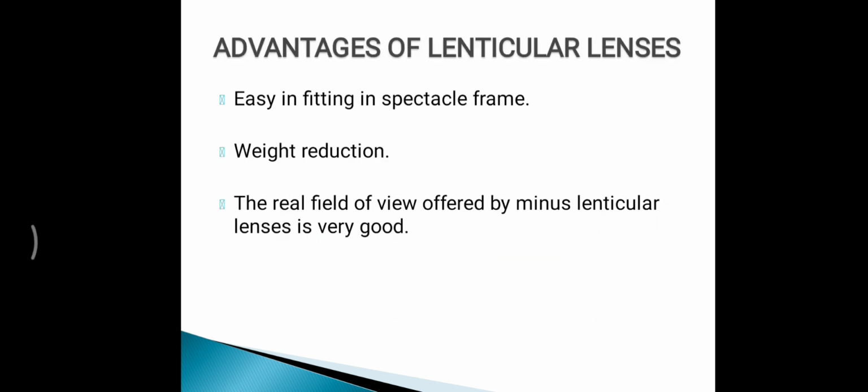So what are the advantages of lenticular lenses? It's easy to fit in a spectacle frame, because if the whole lens is very thick, you cannot put it properly in a frame, but due to the carrier, the prescription will be at the center, and you can fit it nicely. The second thing is weight reduction, again because of the carrier. Again, the main thing is that the real field of view offered by minus lenticular lenses is very good.